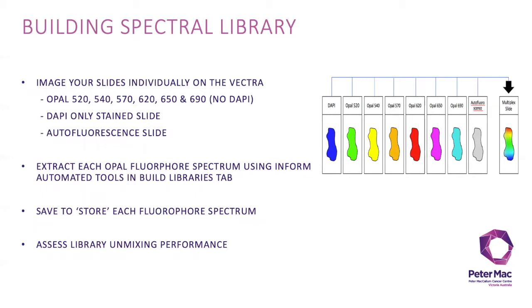You then navigate to the Build Libraries tab in InForm to extract each opal fluorophore spectrum. Then save to store each fluorophore spectrum, preferably with a color that will make it easier to discern in composite view and with a meaningful group tag. And lastly, you assess your library unmixing performance.